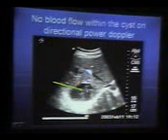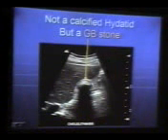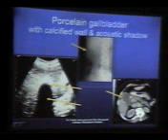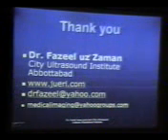This is an appendicular abscess. In the hydatid, there will be no blood flow within. This is a gallbladder, the wall of the gallbladder, and there is a stone in it. This is a porcelain gallbladder. The wall seen on the CT and the plain X-ray. Thank you very much.